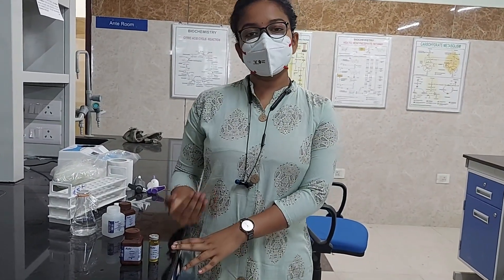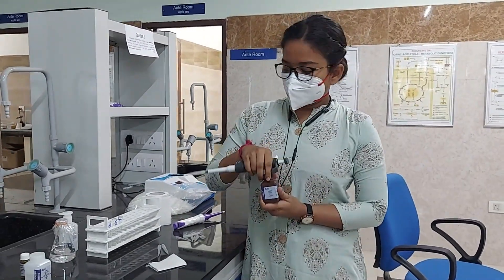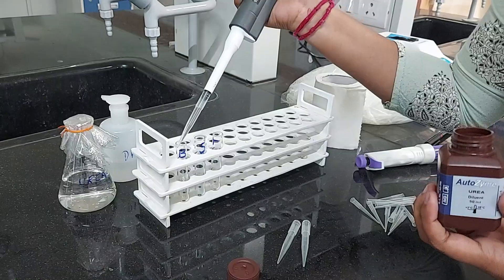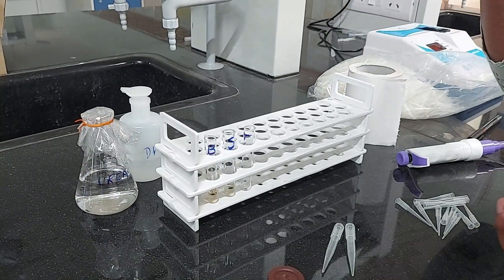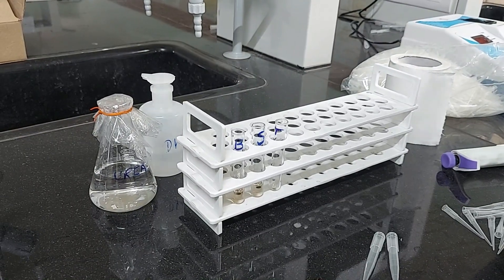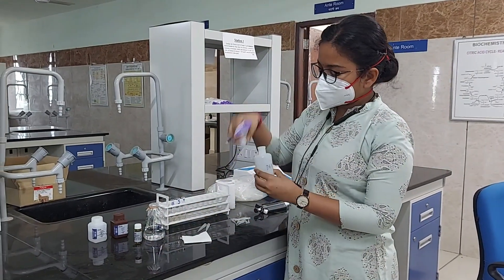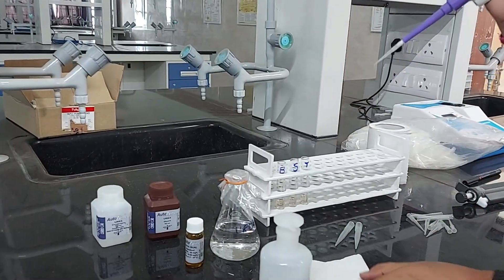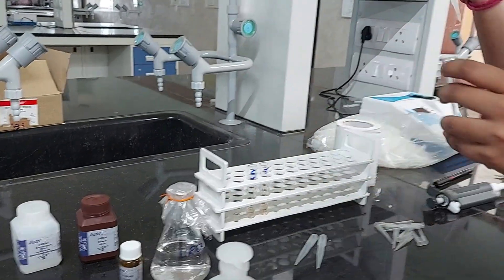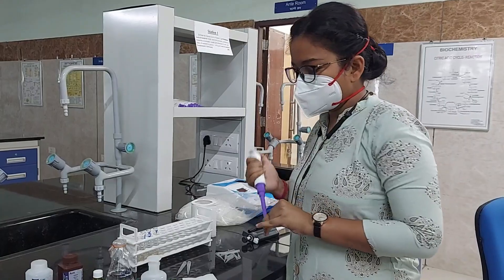We are adding 1000 microliters or 1 ml of working reagent in each test tube. Now I am adding 10 microliters of distilled water in the blank tube. Wipe the excess, mix it well, and discard the tips.